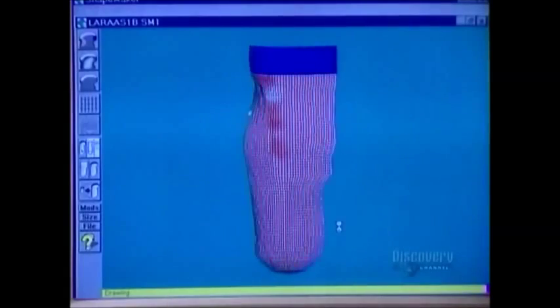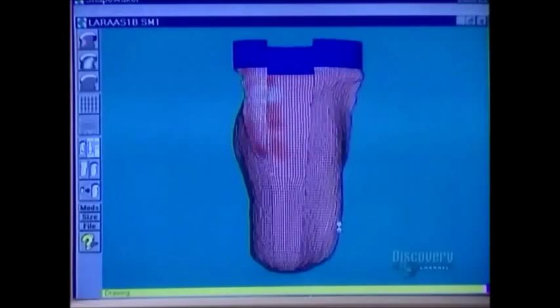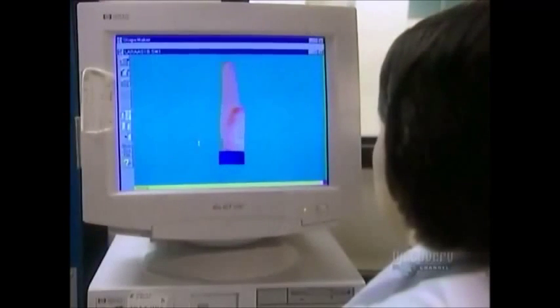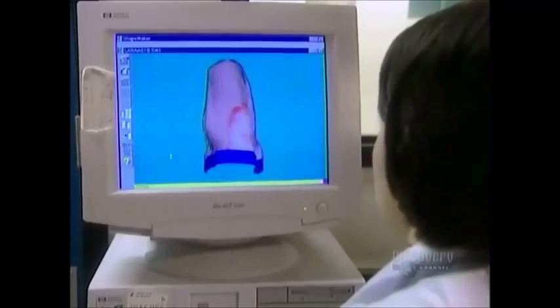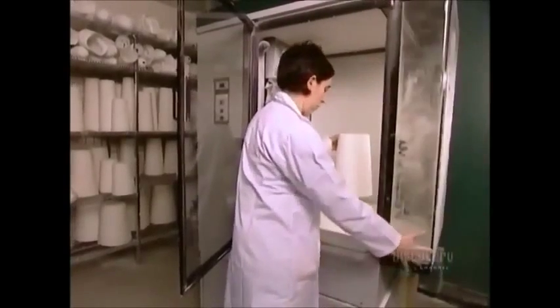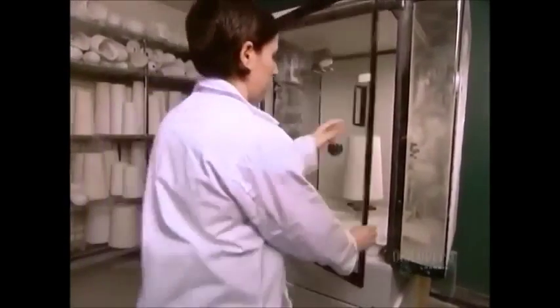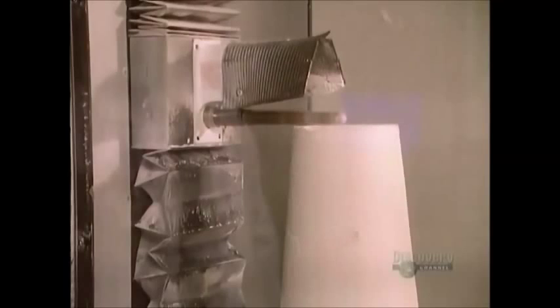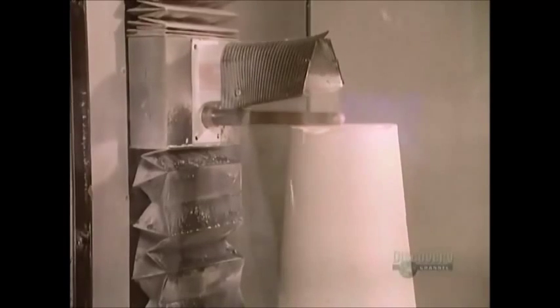A scanner takes a detailed three-dimensional reading and programs it into a computer. A technician then makes any necessary modifications. They put a plaster block on a cutting machine, and the computer guides the blade to carve out the positive mold.